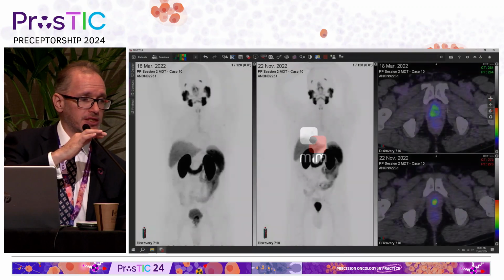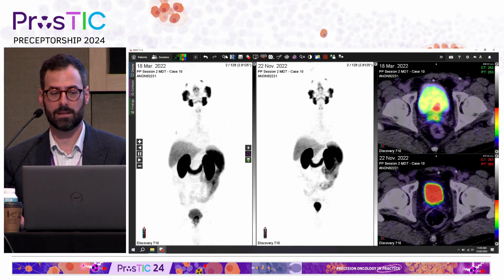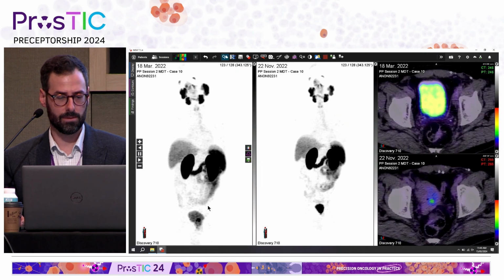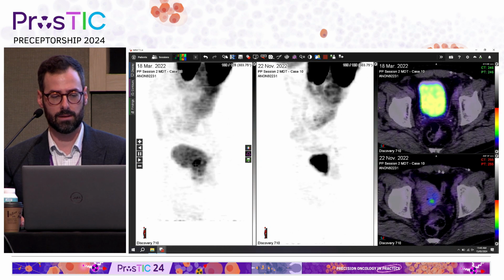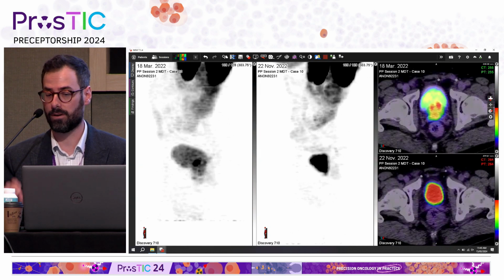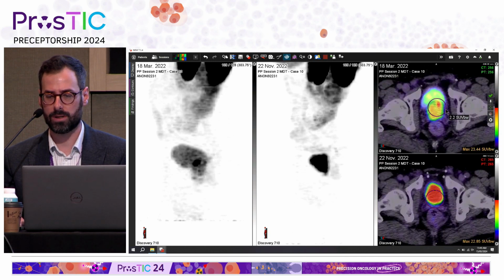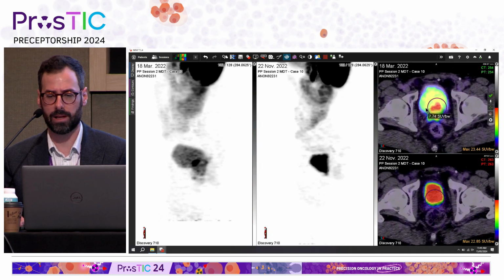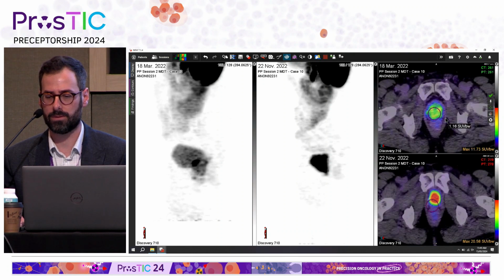Let's have a look at the PSMA PET scan. All right, so you can see the pre-op PET scan to the left, the staging one. Just zoom it in. There aren't any distant or nodal mets. We'll just go straight to the prostate, but you can see there's very extensive involvement. There's uptake throughout, quite heterogeneous. Near the base, just near the junction of the bladder, there's this more intense uptake of 24. I think it actually does look like prostate cancer. It's not just bladder in this scenario, and then the rest is a little bit milder, SUV max of around 10 to 11.